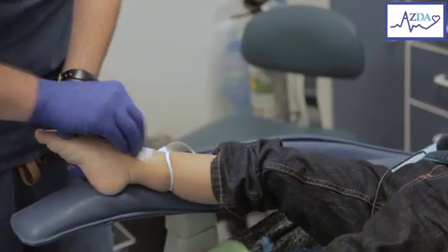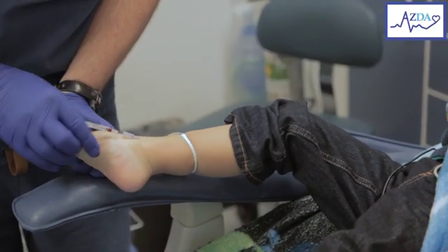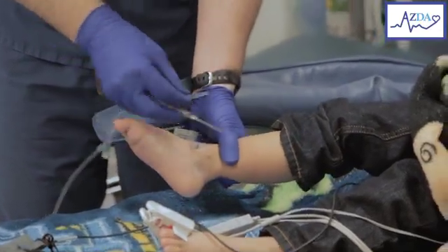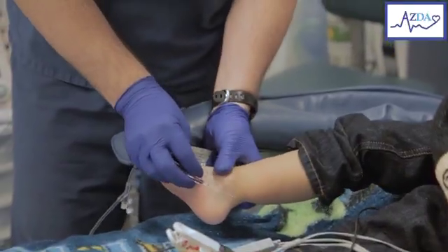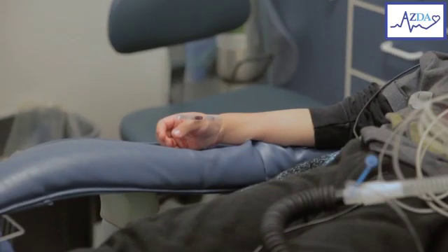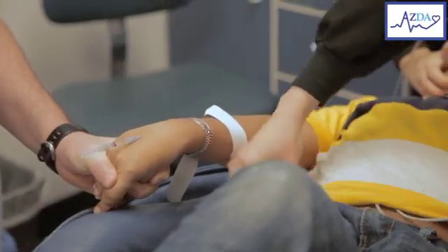In this clip, Dr. Wall is starting an IV on the patient's right foot. He is going for the greater saphenous vein, which is located anterior and superior to the medial malleolus. Other common IV locations are the cephalic vein, the dorsal hand, and the antecubital fossa.